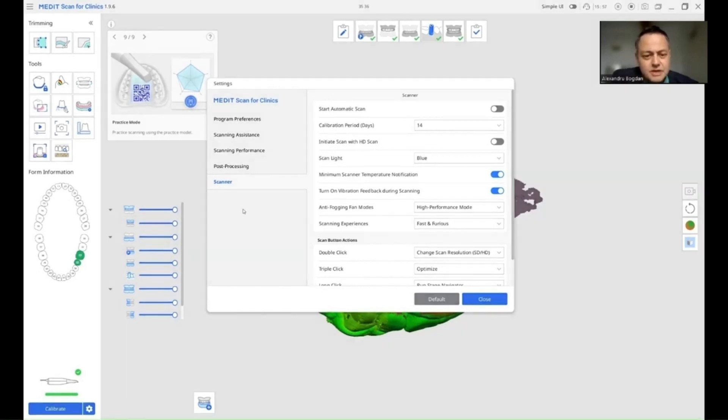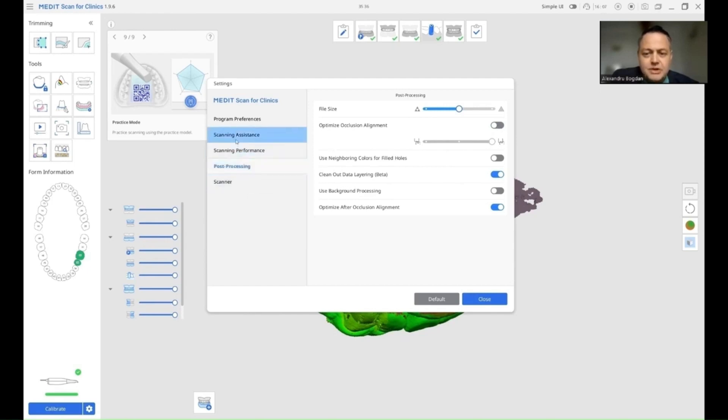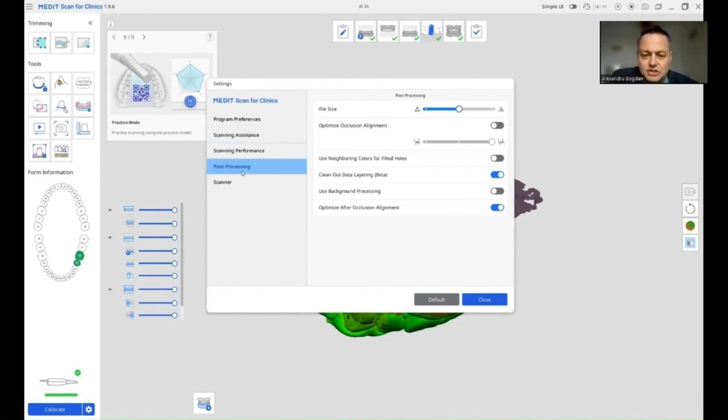Let's see, they are located in the post-processing part. I will turn them off and I generally do so in distal cases because in these cases, the software tries to match the models. Because it doesn't find any parts to match on the implant side, it's also possible to distort these models as positions one to the other. So in these kind of scans, I will disable occlusion alignment.